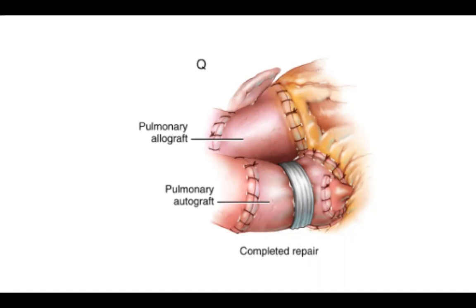And the most important thing, patient prosthesis mismatch, which is well defined by the Rahmatullah paper. If the effective orifice area is less than 0.85, you start to have patient prosthesis mismatch. Less than 0.6 is severe. And you need to anticipate patient prosthesis mismatch pre-op before going to the OR. So before going for enlargement, sometimes you just need to choose a different kind of prosthesis.